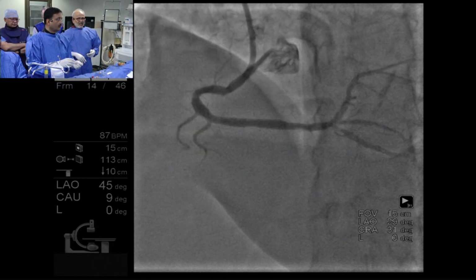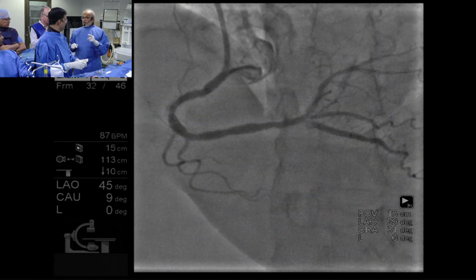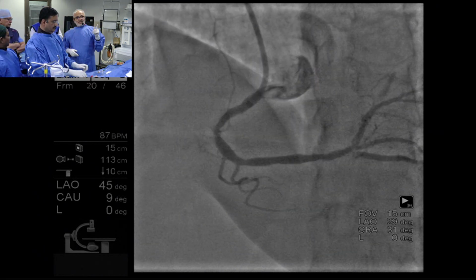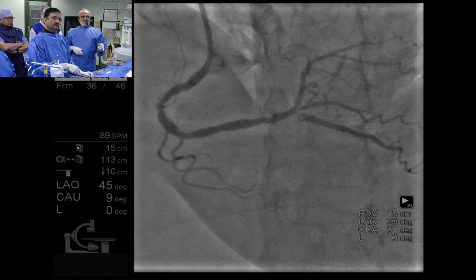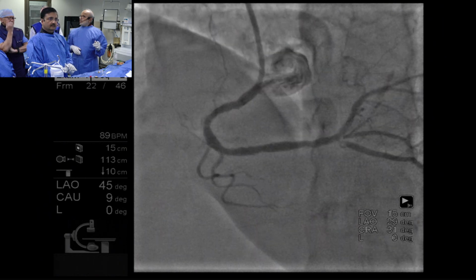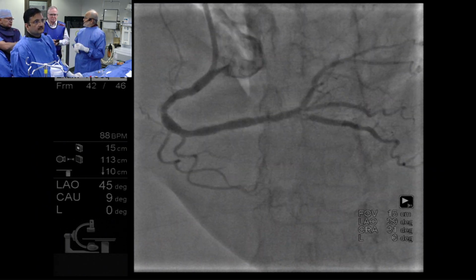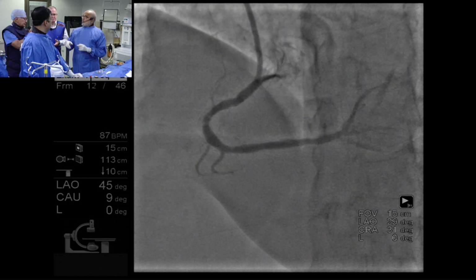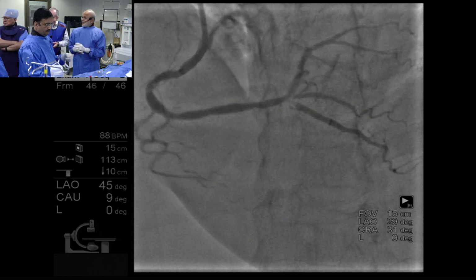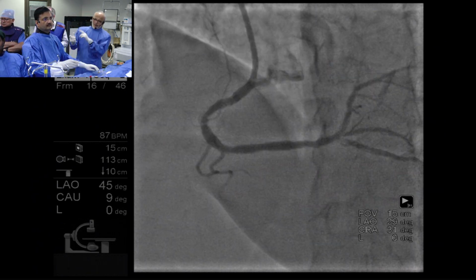We'll try. Can I just come back to OCT, the discussion about the after dilatation. Sorry, for that question, whether you would like to run the OCT at least for the proximal lesion prior to dilatation, or you want to dilate? Because OCT image, I am not sure. What do you think? Dilatation of the distal part, start here. Professor, what do you think? We can see. Okay, I think, yeah, let's do that then.